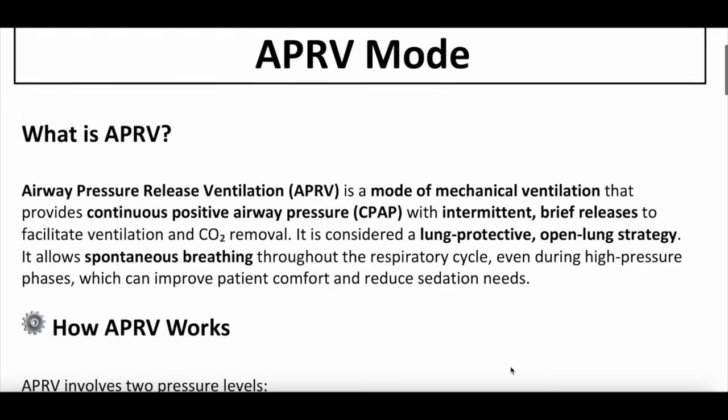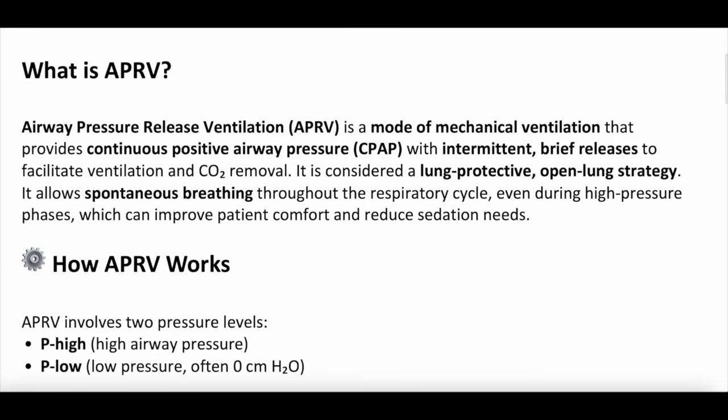So what is APRV? This is a mode of mechanical ventilation, again, that's not super common. We don't tend to use it that much in our day-to-day practice, but you will come across it, and it might be something that becomes more prevalent as time goes on. But APRV stands for airway pressure release ventilation.